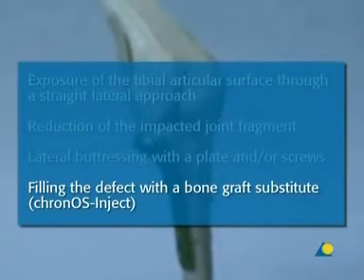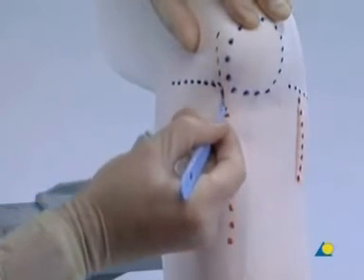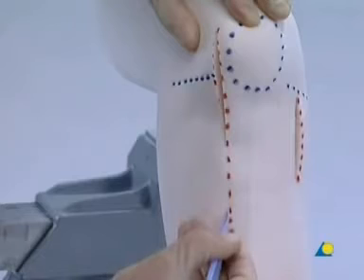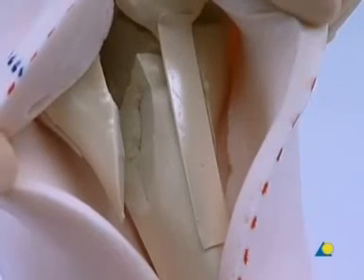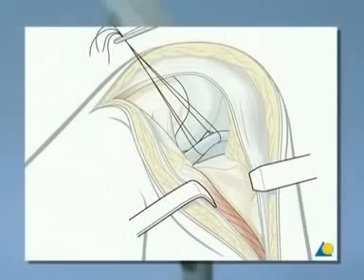For the surgical approach, a skin incision is made running laterally to the patella and tibial tuberosity. It proceeds directly down to the bone without separating the tissue layers. In the clinical situation, the knee joint is opened by a horizontal arthrotomy distal to the meniscus.